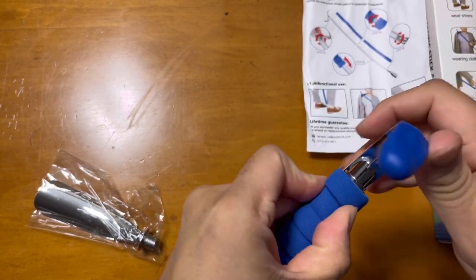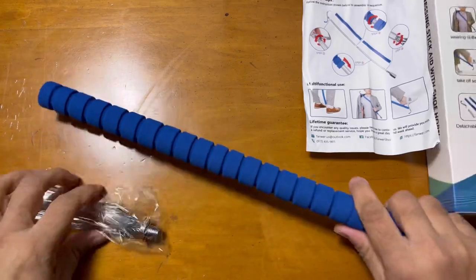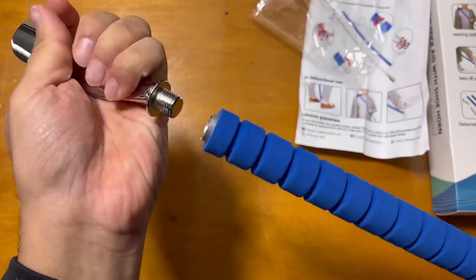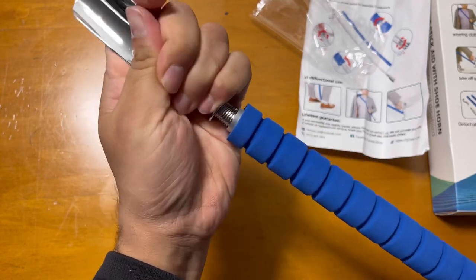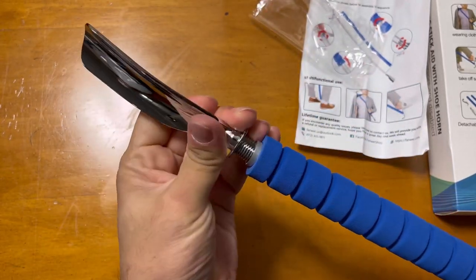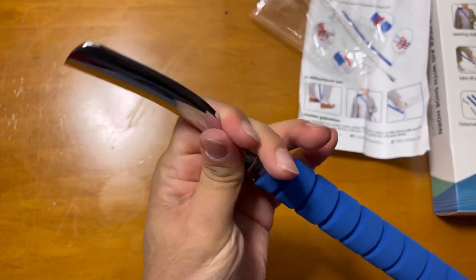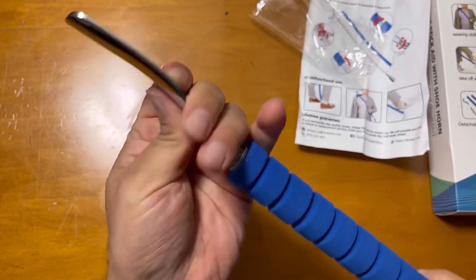Then once you fix that, the other side is for the shoe wearing. Same thing - just push a little bit and start rotating it, and it will just go in place.